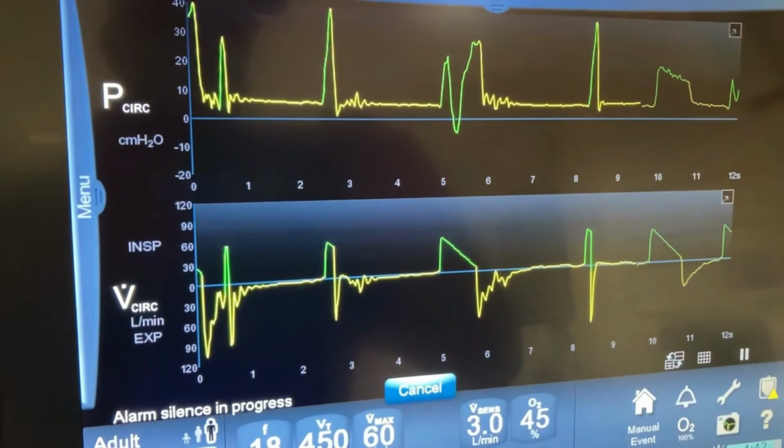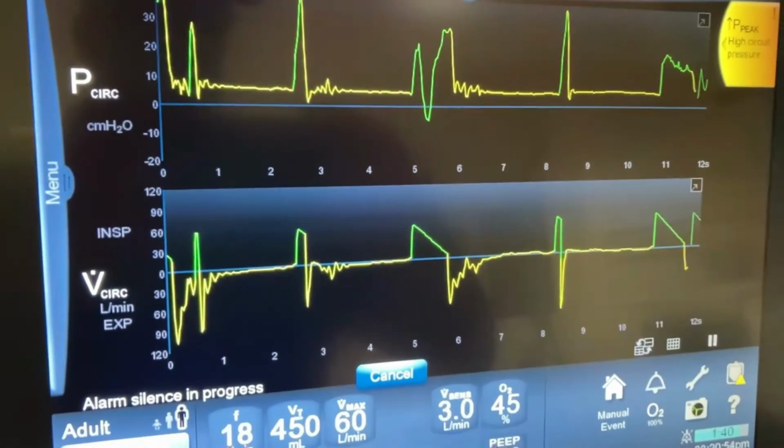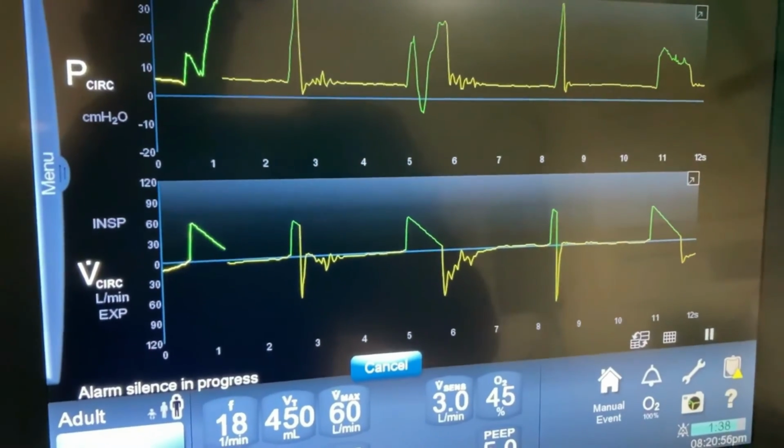And here you can see the moving images of what we just talked about, and you can hear the secretions.